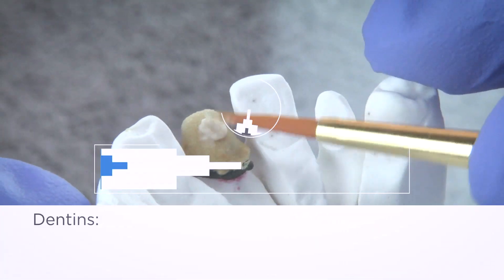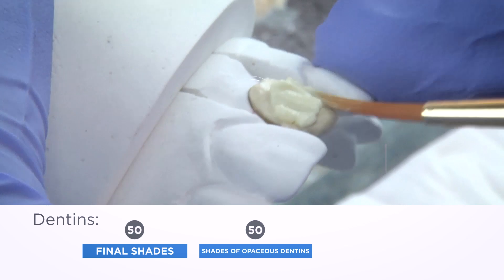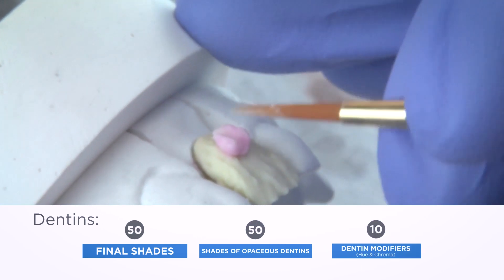Dentins: Standard and opaceous dentins are offered in all 50 shades. Opaceous dentins are 10% more opaque than regular dentins.